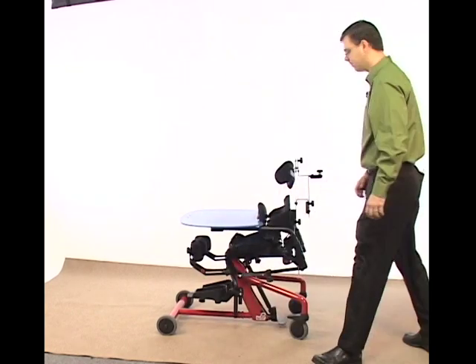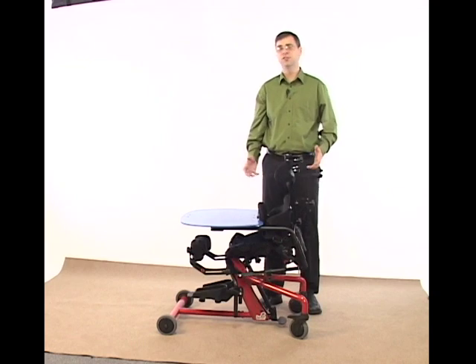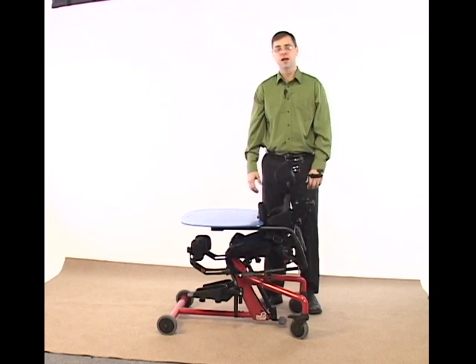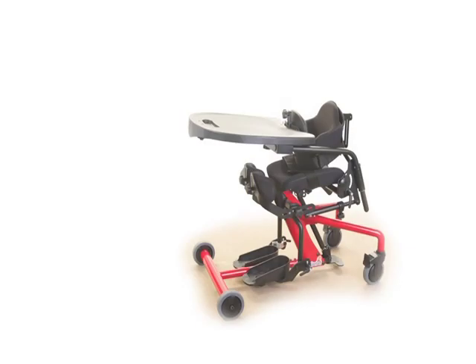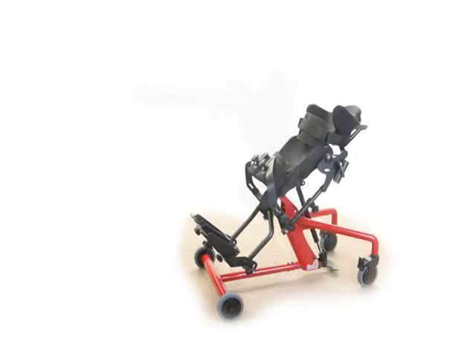Good morning. My name is Andrew Gardeen and today we're going to take a closer look at adjusting and fitting properly the Easy Stand Bantam. The Easy Stand Bantam is the latest pediatric stander from Ultimate Medical that accommodates children in a seated position, a standing position, or even a supine position.